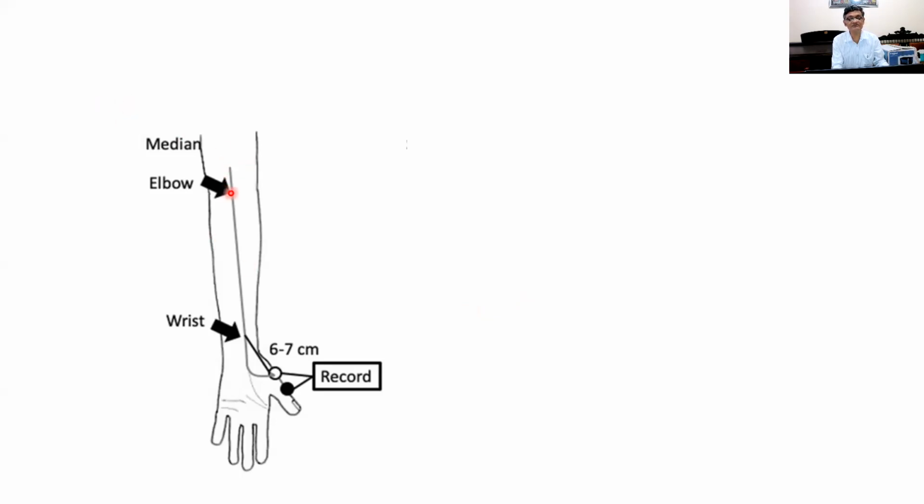What we do is, that is why at second MBBS level you must learn your anatomy well and also physiology, because if you are doing this, you must know where the median nerve is going. Using surface marking, you should be able to guess, okay, underlying this area under the skin, the median nerve must be there, and you place your stimulating electrodes in the antecubital fossa or in the elbow region, where you think the median nerve is, and you stimulate.